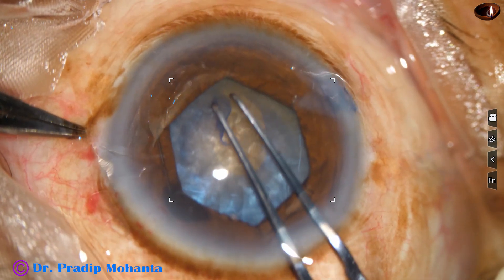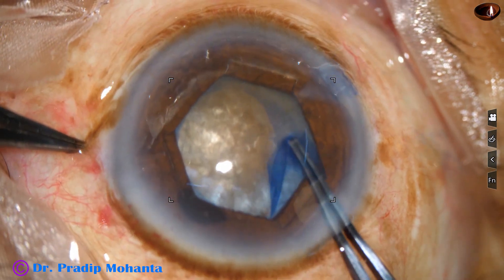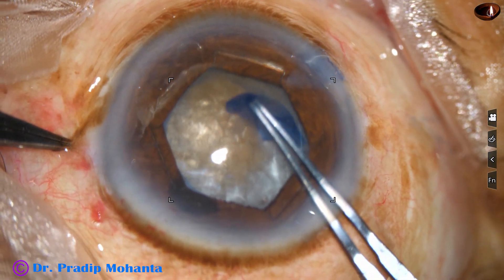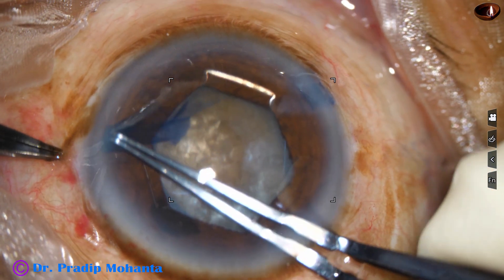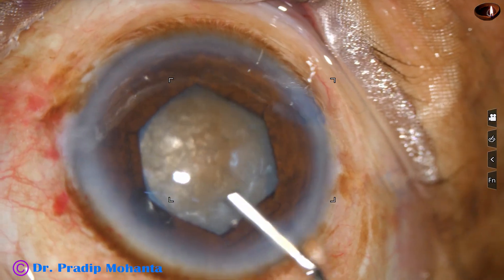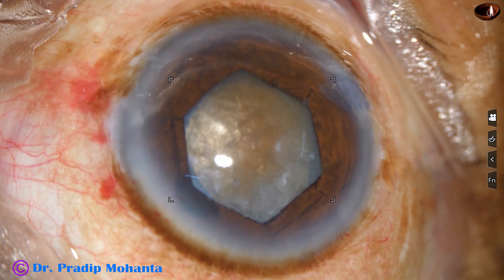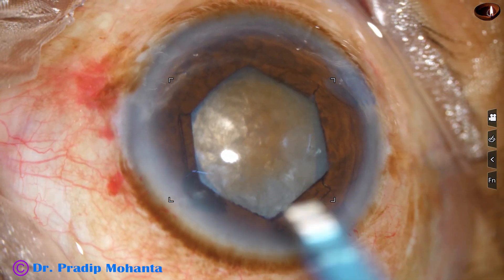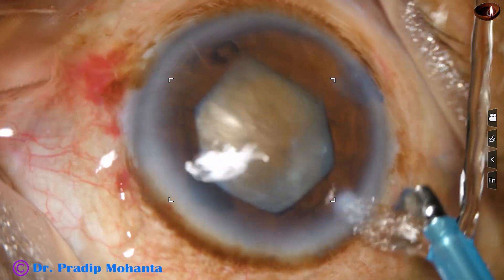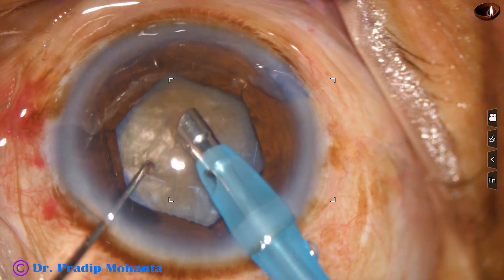After making a small nick, the capsular tag is held and the capsule is guided all around to get an adequate size of access. Since this is a hard cataract, I tried to go beyond the pupillary margin in some places to get a larger rhexis. Now we have overcome two challenges — rhexis is done and we have made the pupil of adequate size by applying the B-Hex pupil expansion device.